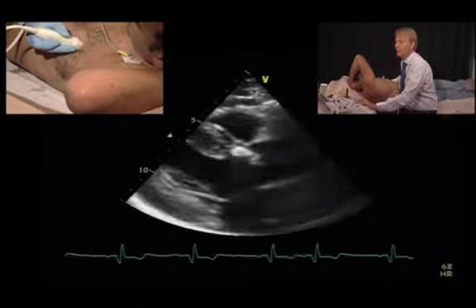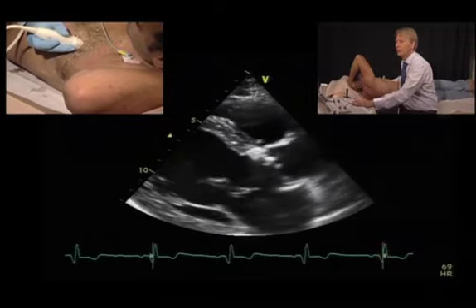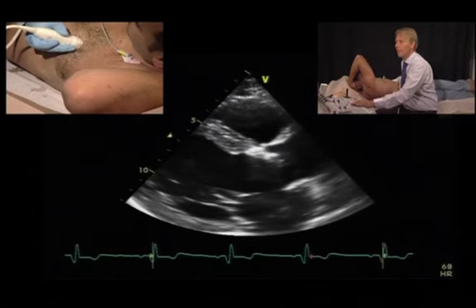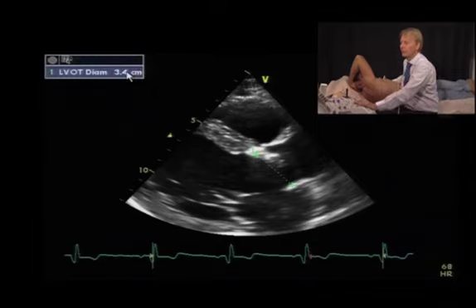Then to optimize the LVOT, freeze the image. Then we have to choose the frame where the aortic valve is open. And then we take the diameter of the LVOT right at the insertion of the aortic valve. And in this case, we get a very wide LVOT of 34 millimeters.